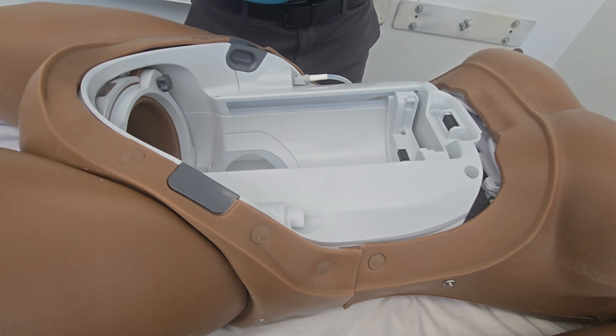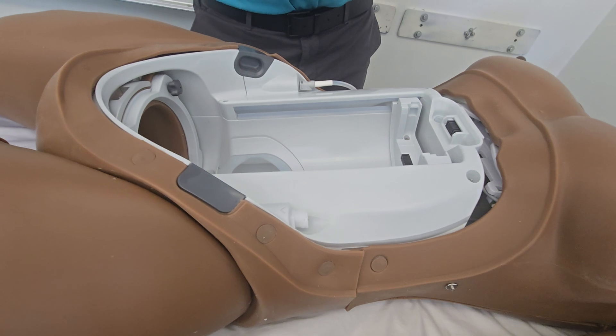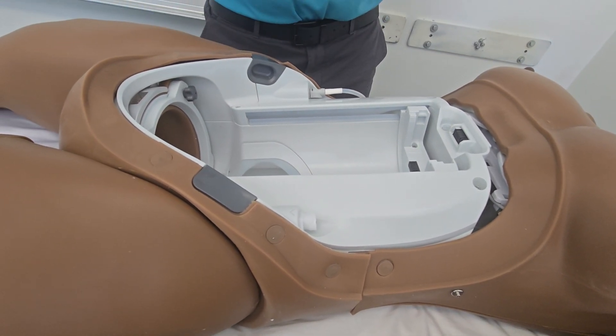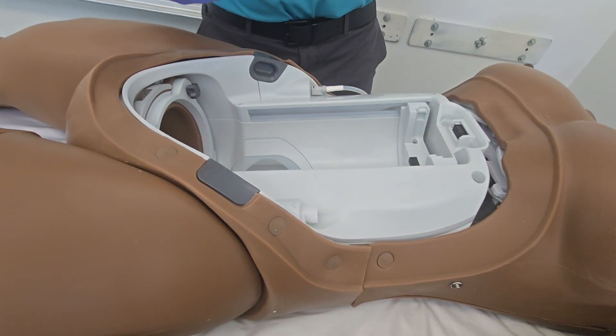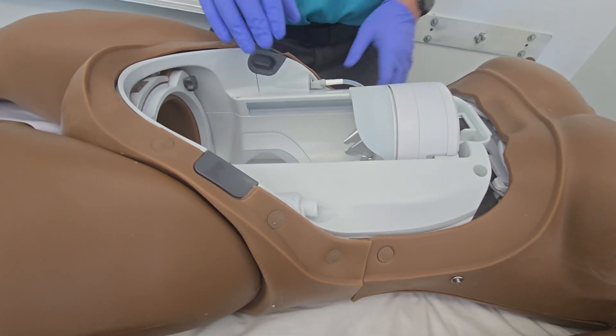Try not to get lubricant or water near these pins. If it gets on other parts of the delivery puck it's not the end of the world, but mainly we're focused on these pins not receiving any fluid contact. When we're putting this in we're going to have this face down. This slides in — you should hear that click.